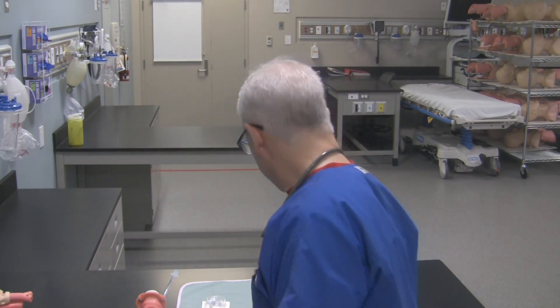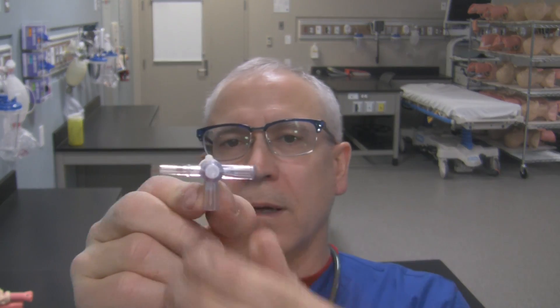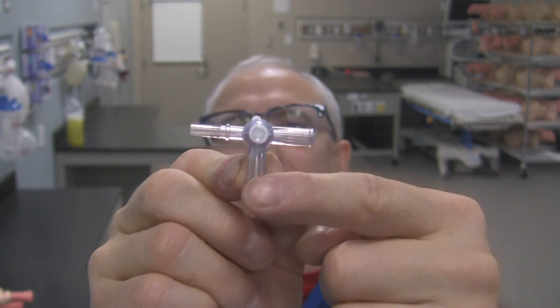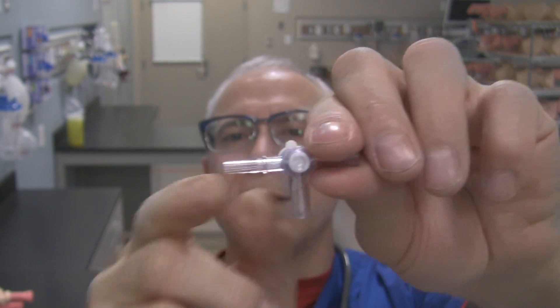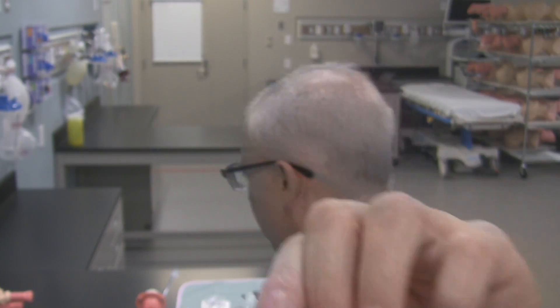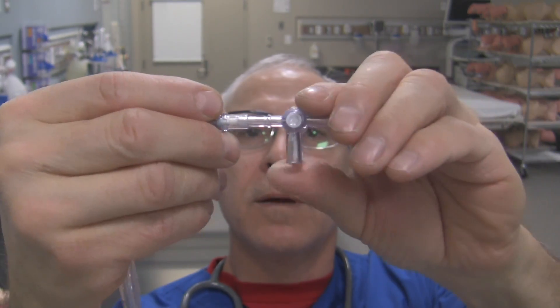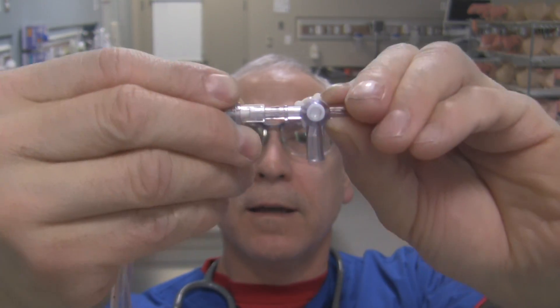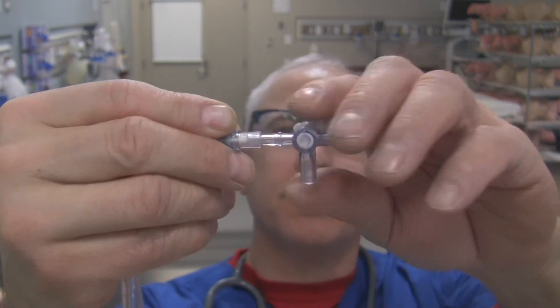Now what we use in respiratory therapy when we're doing cuff pressure checks, we like to use this style of three-way stopcock. It's got the two female luer lock ends and then it also has the slipped male end. We like it because this long slip male end is big enough to fit into the pilot balloon of the endotracheal tube. Here's the pilot balloon for our endotracheal tube — that slips in there rather nicely and stays secured. So we can open up the channel that goes to the cuff of the endotracheal tube.